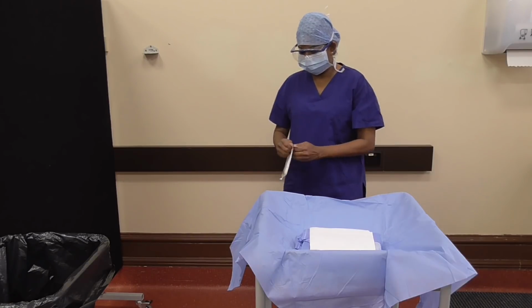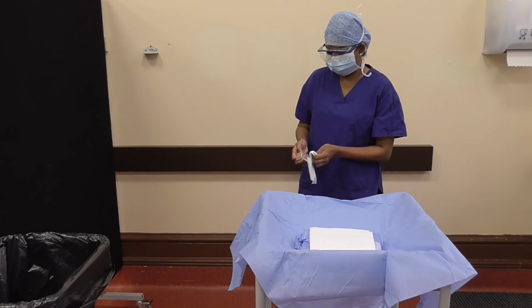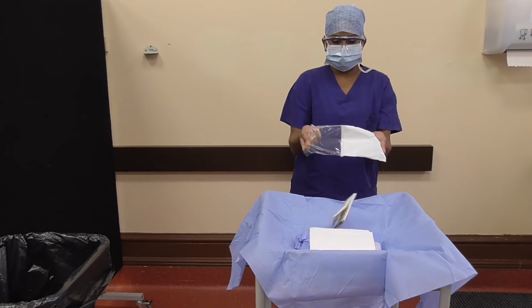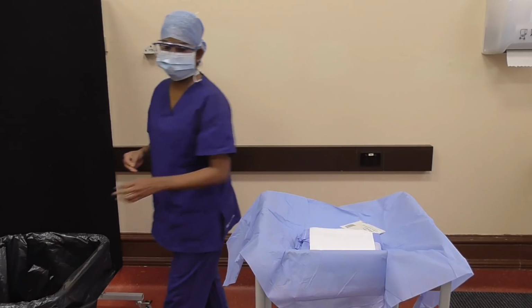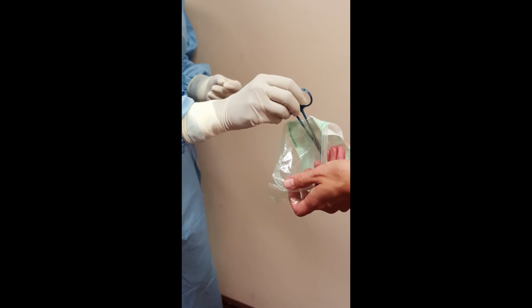Get the appropriate sized glove, ensuring the packaging is intact, confirming sterility. Make sure not to rip the packaging. Open it away from the sterile field and flip it onto the field. This is the only time in theatre that you would do the flipping method. If you are scrubbed and need an instrument, ask a co-worker to hand it to you as shown.